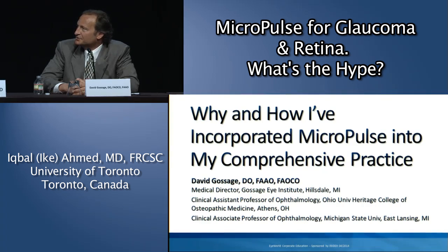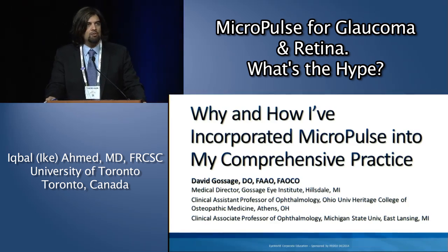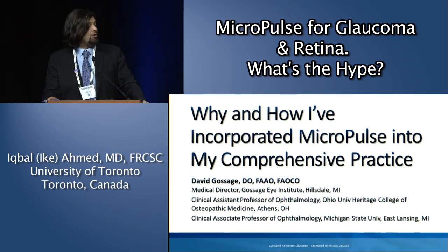Yeah, and I'll echo that. I was very worried because we've had some spikes, and some of our colleagues in Canada have reported IOP spikes post SLT. And surprisingly, again, using these settings, even with a pigment dispersion eye, we're actually quite happy with it. I'm cautious though, and if I see a reaction, I'm going to be worried. But so far it's been good. So I would put an asterisk on that. I would say that for pigmentary eyes, we want to be a bit cautious. If you're not sure, turn the energy down. But so far, at least, it seems to have been pretty successful.